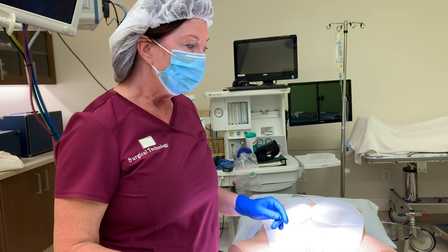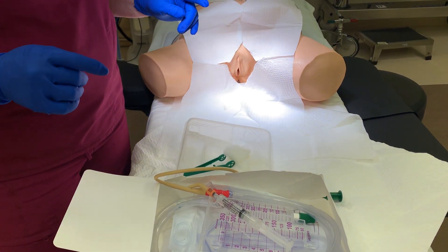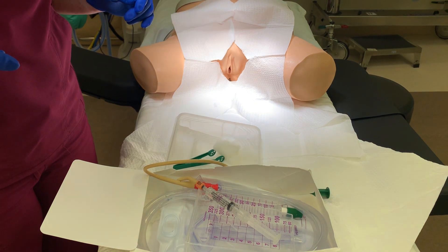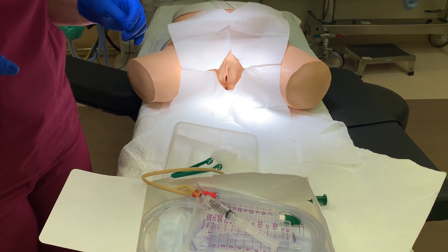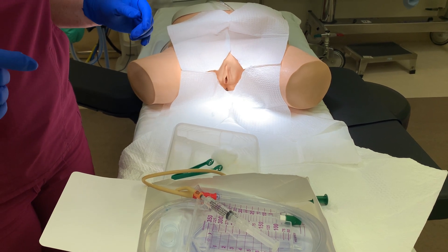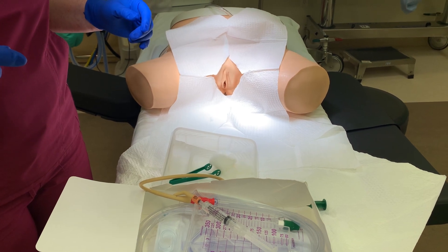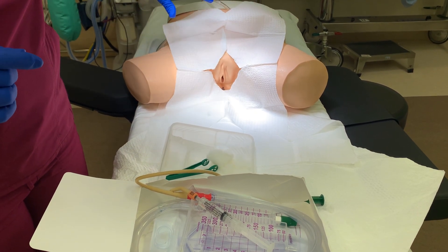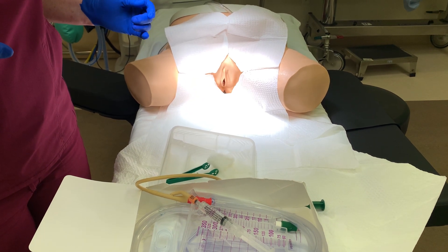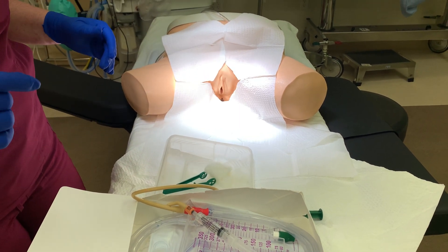We're about to perform female urinary catheterization. There are specific differences besides the anatomy between the female and the male patient for urinary catheterization. The first thing is on the female patient, the legs would be in what is called the frog leg position in order to present the perineal area the way we need it to be. So the female will be in the frog leg position.